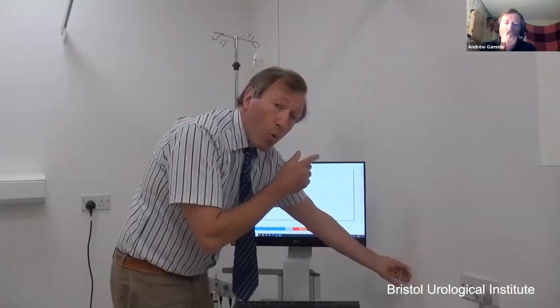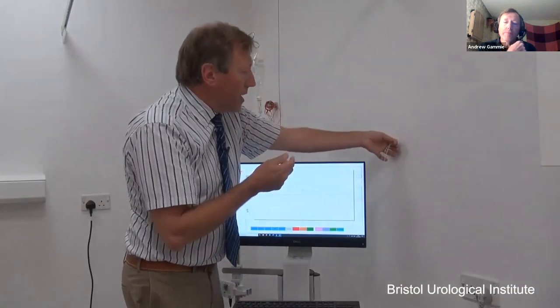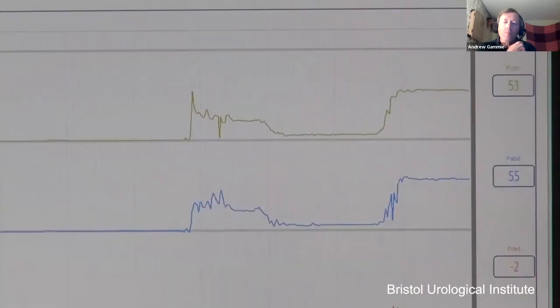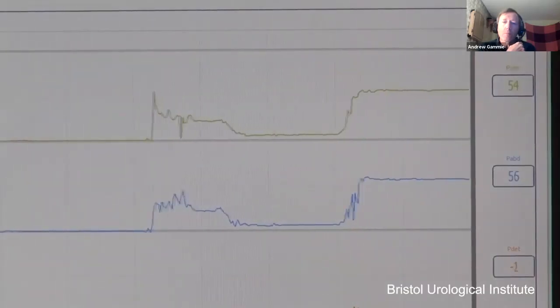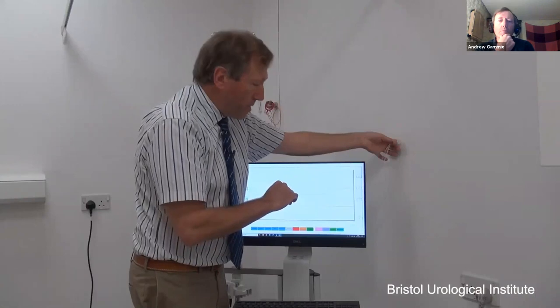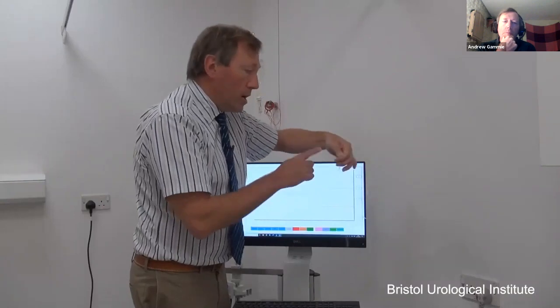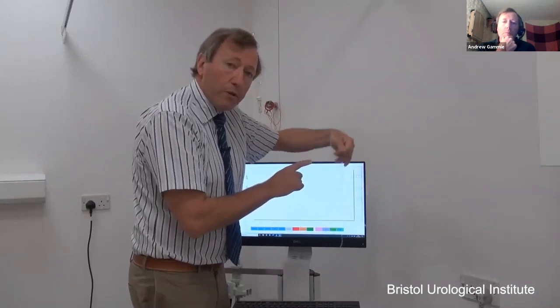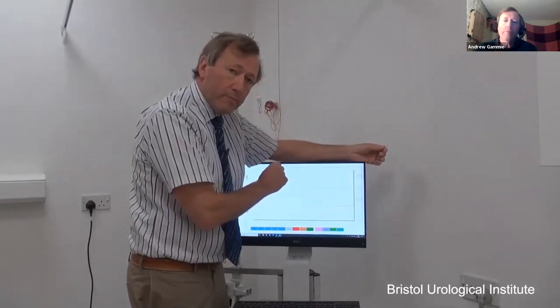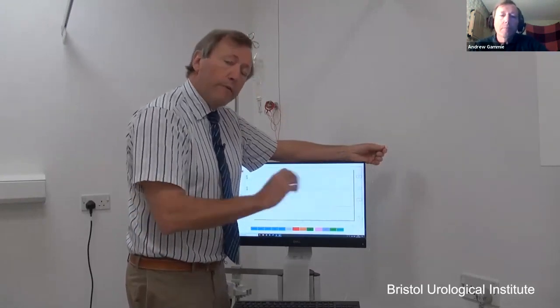So if I raise my water-filled tube up, I should see an additional pressure on the lines. And I've got a marker here that is 50 centimeters above that starting point. And you can see that my pressures here are 55 or 56, which is indeed 50 centimeters above where I started at 6. So I've now confirmed that my system is within calibration, because a change of 50 centimeters height in my water-filled tube gave me a change in reading of 50 centimeters on the screen. My calibration check is complete. I'll make a small note of that in my log so that it is recorded for future reference.